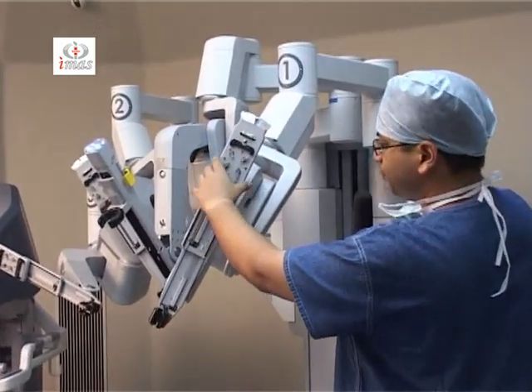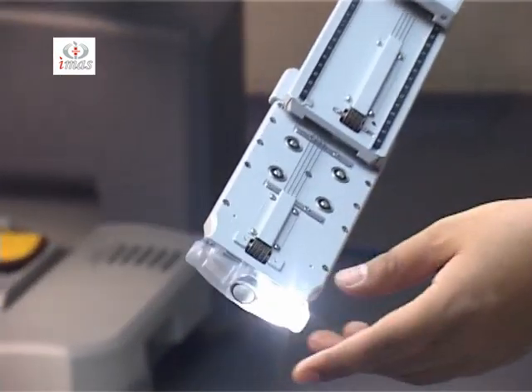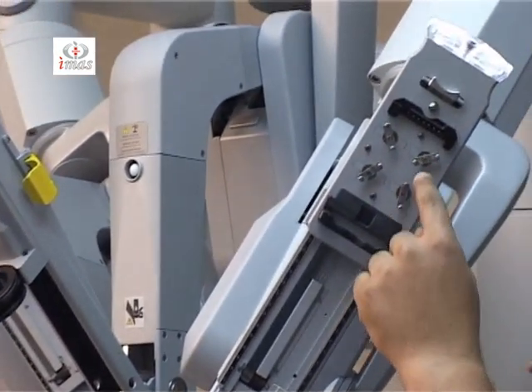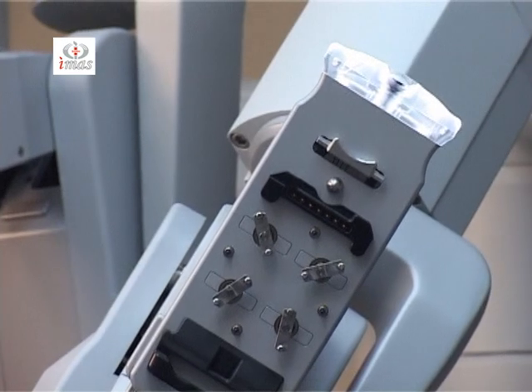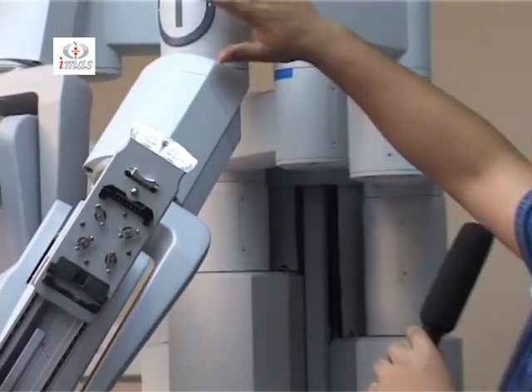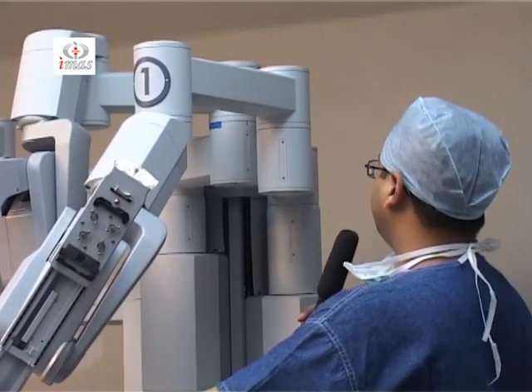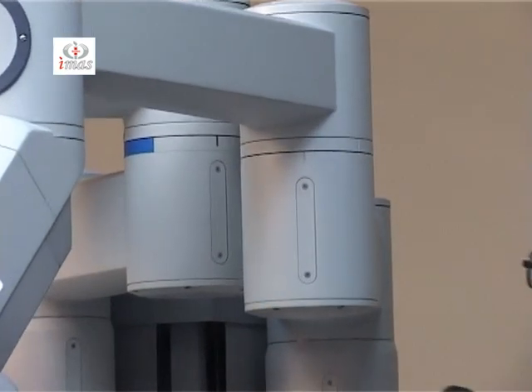As you can see, this works on a pulley system. There are various pulleys. You can see here pulleys and cords, and they move, they provide the endowrist function to the instruments, and various wires are running, and there are motors. These are the motors which rotate, and they rotate various wires accordingly in order to simulate the movement of the surgeon's wrist onto the instrument tips. These arms are numbered 1, 2 and 3, and if you can see here, there is a mark here which can be rotated with the help of the port clutch button.